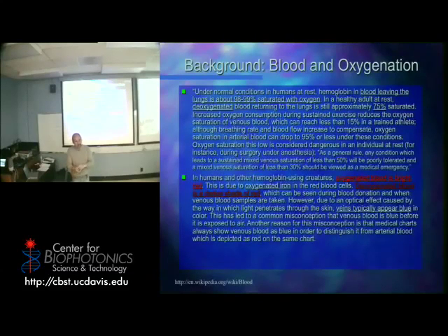Blood that, when you just cut it and it's exposed to oxygen, has that bright red color. Over time, it tends to change somewhat. There's so much other oxidation and other breakdown reactions that happen once blood is out for a while. I'm not sure what all that chemistry is. But you're right, it does get darker. Okay?